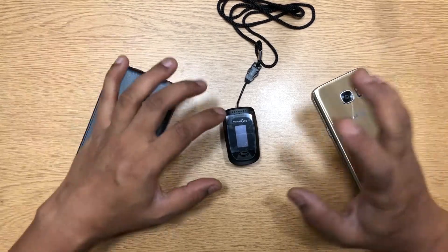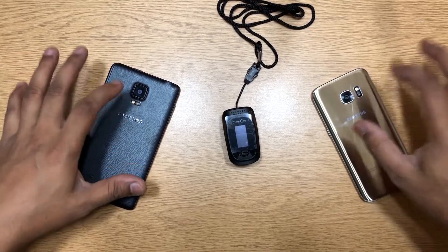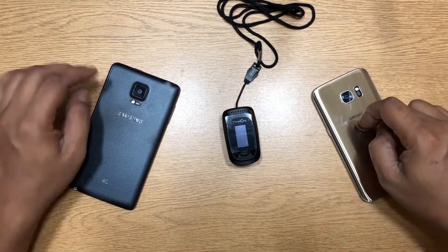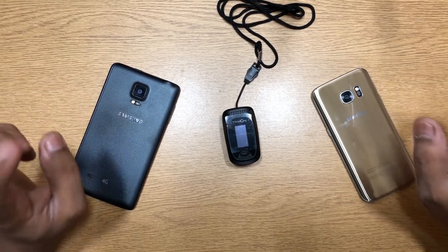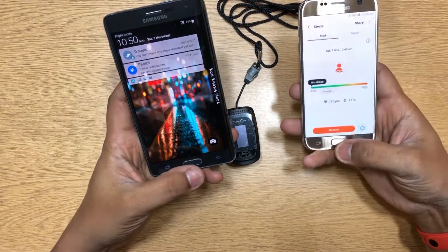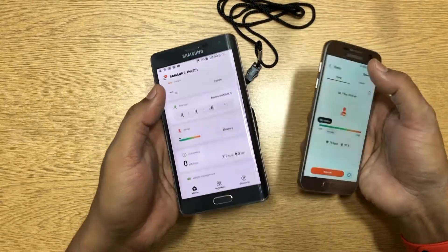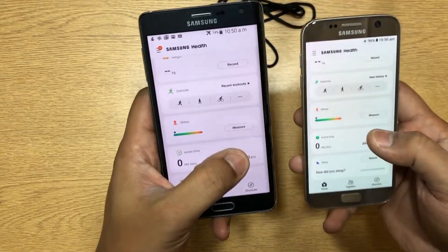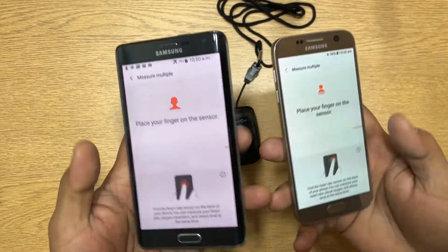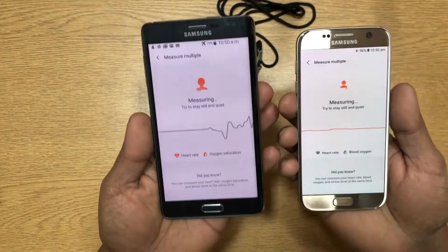Now let's take a look at alternatives to the pulse oximeter. Samsung premium devices have built-in pulse oximeters — the S series S5 and above, and Note series Note 4 and above. To use it, go into Samsung Health and select the stress option, then hit measure. At the back you have the sensor — just put your finger there and keep it.